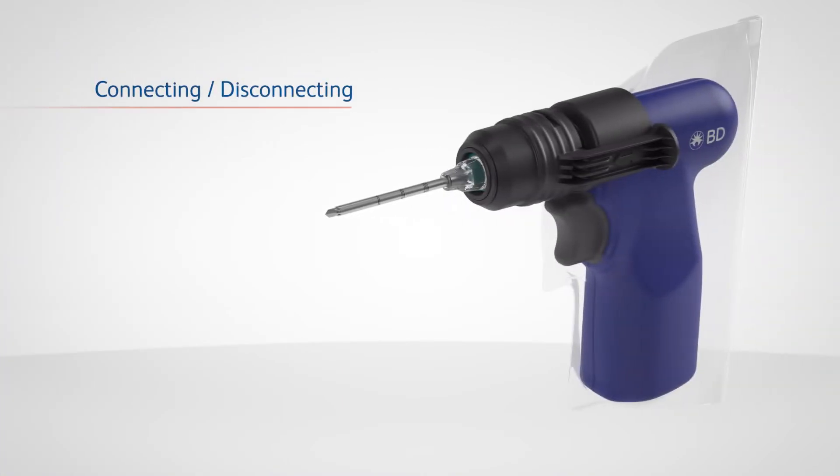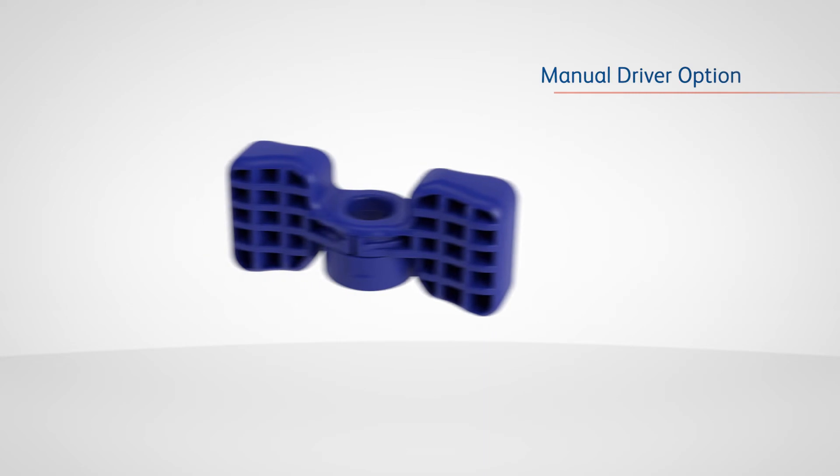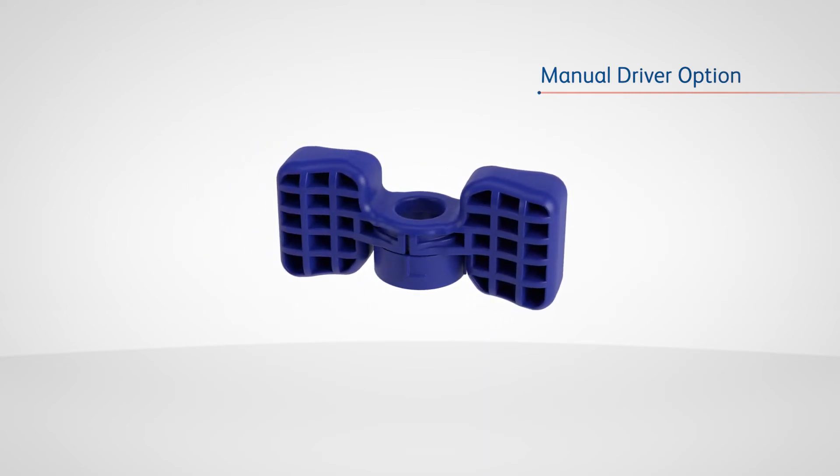Ensure the stylet and introducer cannula needle assembly can be connected and disconnected without difficulty from the Quick Connect Hub. At any point during a procedure, the optional manual driver can be used.